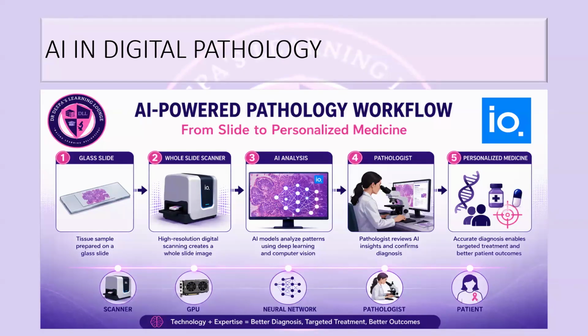Suppose you are a pathologist working in, let's say, a CRL, where 10 other laboratories are referring cases and sending you slides, and you have a cumbersome, excessive workload to deal with. Then unless you have an AI helping you diagnose, it is going to become more and more cumbersome, because right now the amount of delivery that you give out is also gauged. That is the reason why you need to adapt this. Sooner or later you have to adopt this.